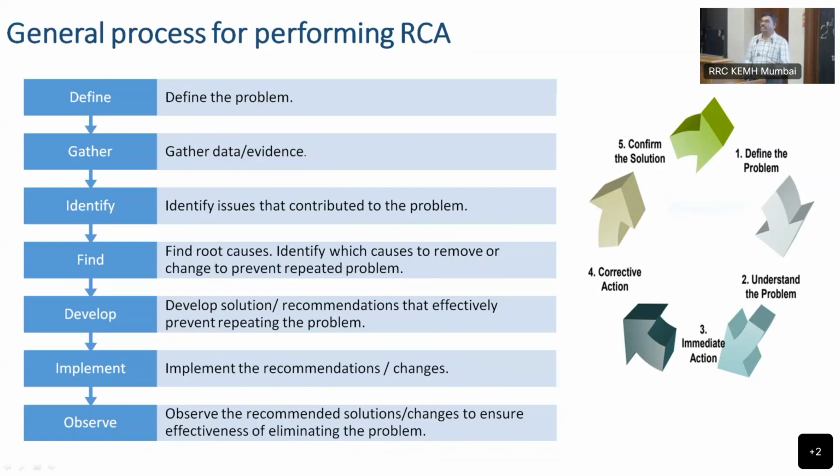When I checked the logistic data, by checking two things, transit delay, transit time, and secondly temperature on receipt. And we have temperature logs also, electronic logs. When I saw it, transit delay was also there, and temperature on receipt of the sample at the lab was always on a higher trend as compared to the others. That is the root reason. So the reason was related to logistic issues.